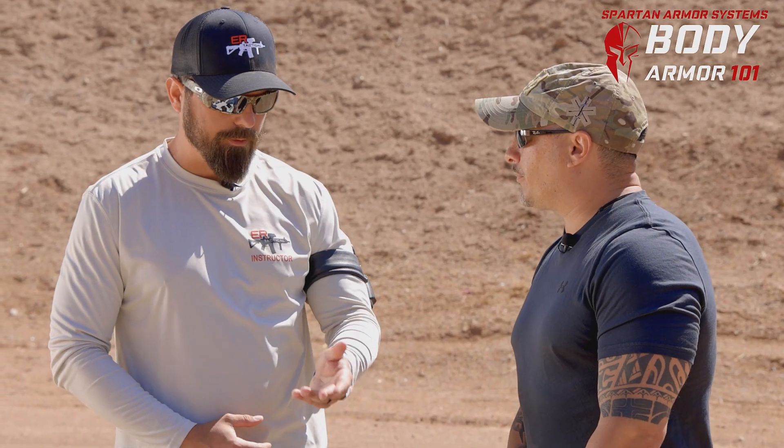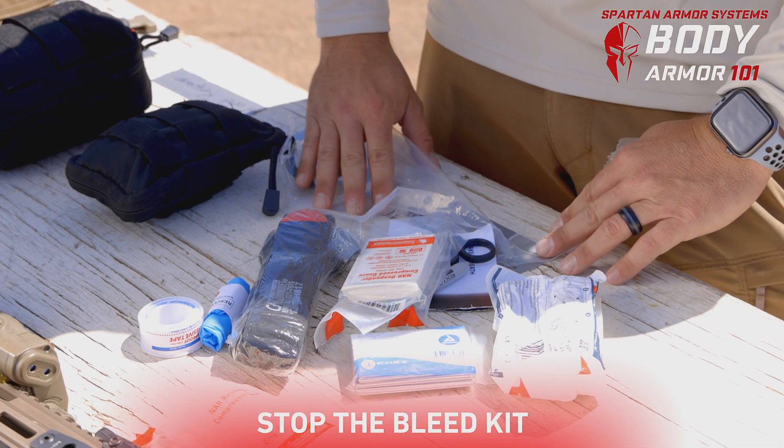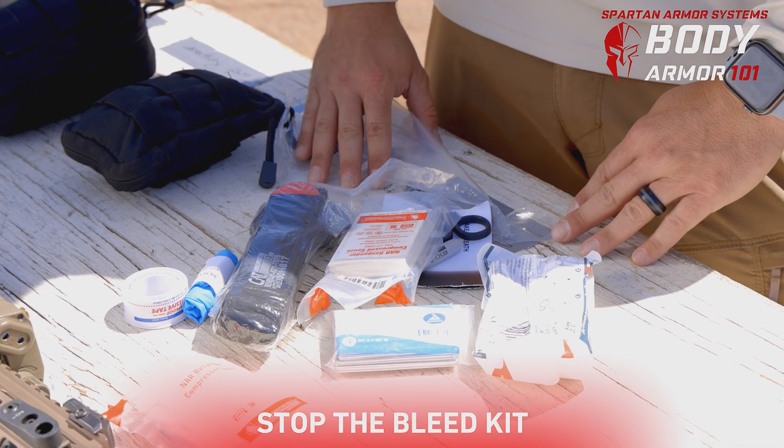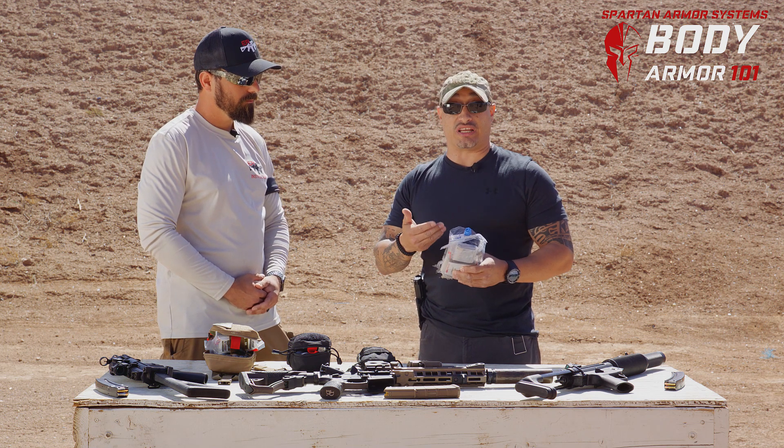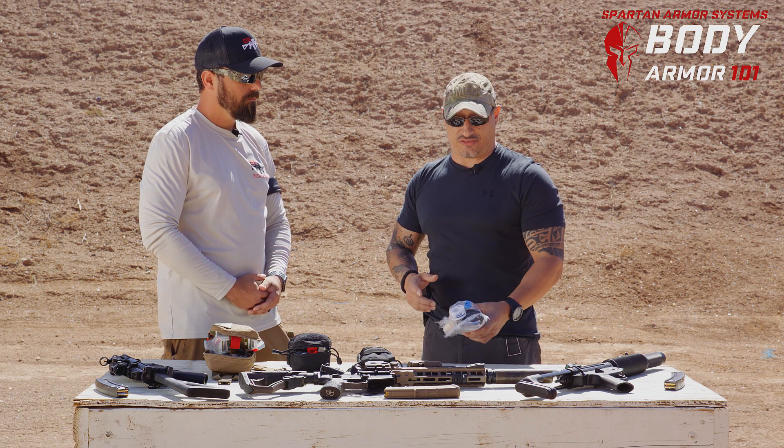Let's start with the Stop the Bleed Kit. The Stop the Bleed Kit is designed to stop any major bleeding that anybody would incur. This is basically the sister version of CPR — it will address any major bleeding that you're going to have to face.